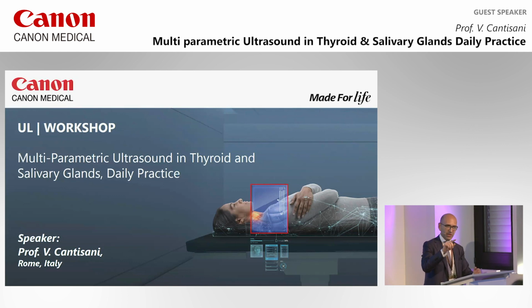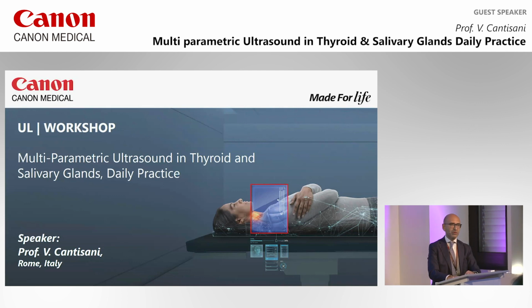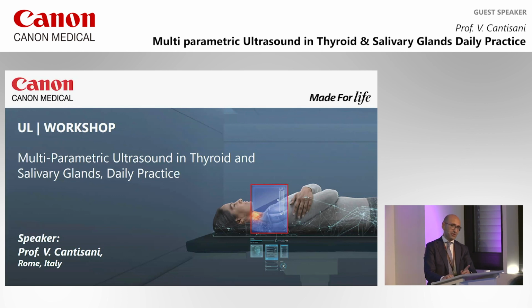For instance, the TIRADS 3A I showed, we published 3 papers. Among 1,000 cases that we have done with the 3A, we saved more than 90% from the operation, because we achieved 90% sensitivity by using elastography. Still, we are working on it to try to reduce even more. But we reduce it by at least 10% for sure. Of course, the surgeon should trust us, and also the patient. But if you explain that in the worst scenario, even postponing the operation, the outcome will not be too much affected, the patient accepts.